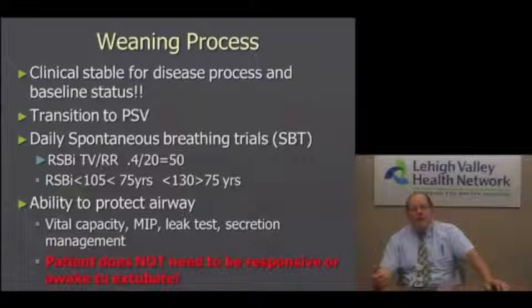If they're greater than 75 years old, we'll let the RSBI go up to 130 because of the pathological changes of the skeletal muscles of the elderly population. Now keep in mind, again, for certain patients it's going to be very difficult to get the perfect RSBI.